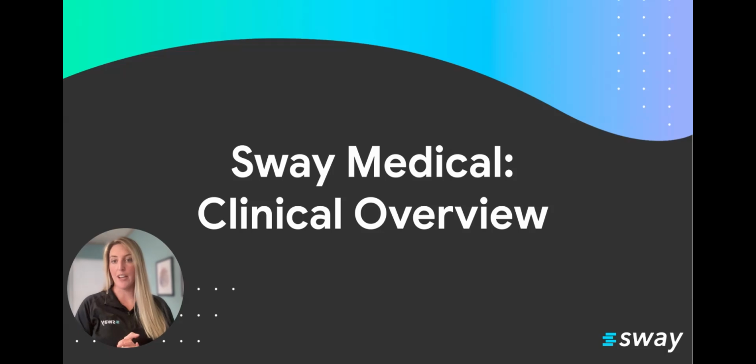So today I'm going to give you guys just kind of that clinical overview of how to use Sway in the clinic, certainly for your concussion patients, but also as an objective balance and cognitive tool. This is something that I did before I came to Sway. I was a customer and had to convince upper management of why I wanted to use this software and technology in my clinic. So let's dive in.